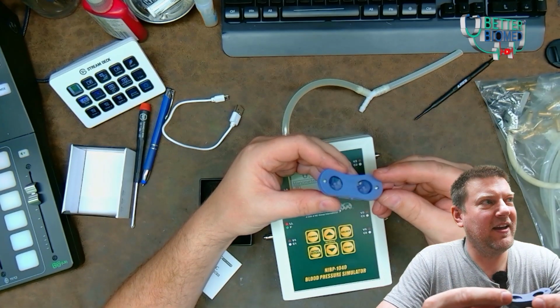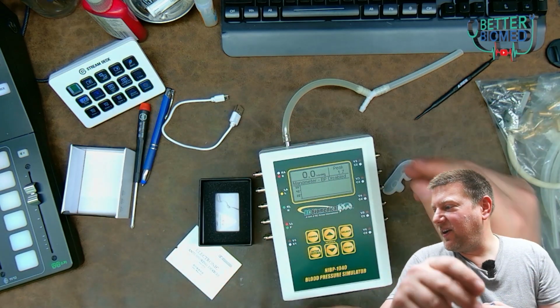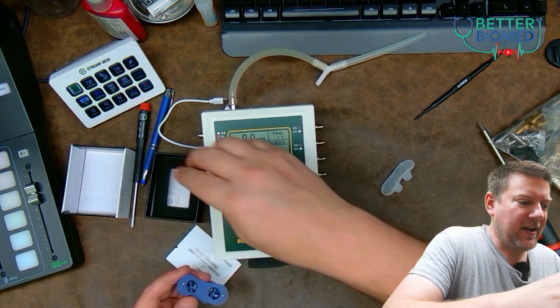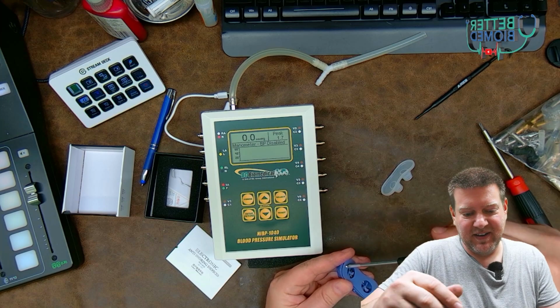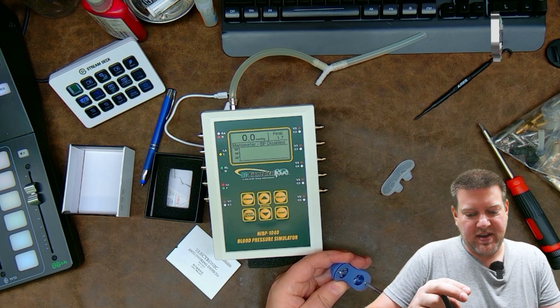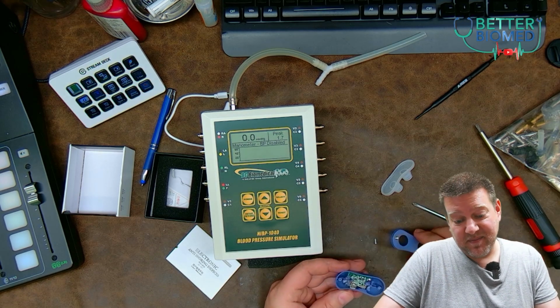You see the little fans, they're right there, they're running. They're doing their darndest, that's for sure. They're running their little butts off. But tell you what, let's go ahead and open it up and take a look and see what's under the cover. This guy, it's clearly, I don't even want to say it's a novelty item, because you wouldn't buy this for somebody as a joke. It's just the fact that it's a scam.